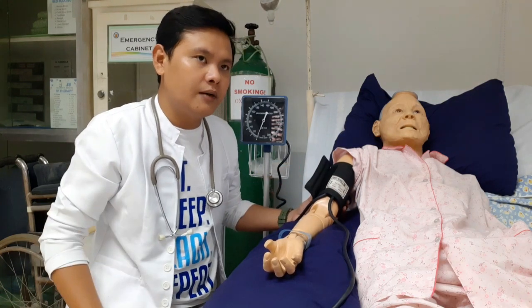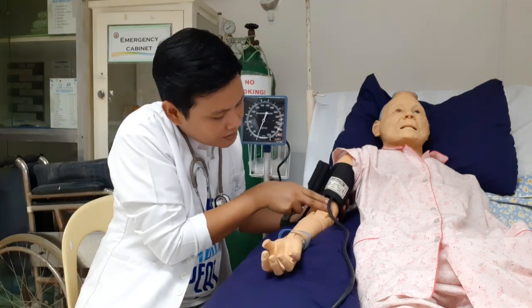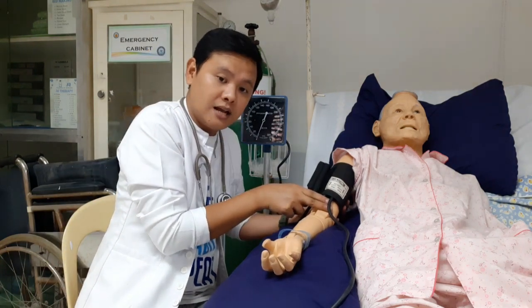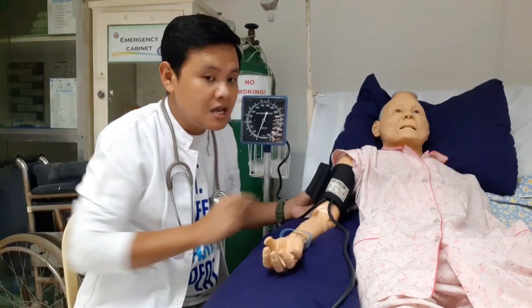Okay, so isa sa mga ginagawa natin para mas madali itong ma-identify is we put our fingers, at least 2 fingers above the antecubital fossa. Above that, doon mo ilalagay yung lower part ng BP cuff.